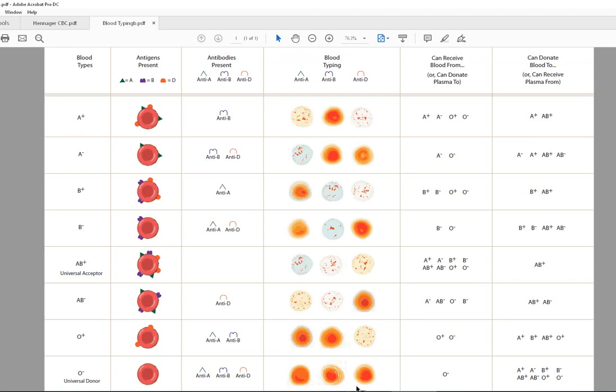one of these, and cut it out and put it on the practical, you should be able to say, and then you have to watch the video first, this one's clumping, it's not clumping, it's not clumping. Since it clumped here, it's A negative blood, so you should be able to say this is A negative blood. So that's also fair in the practical.